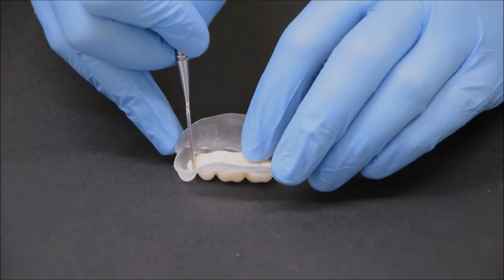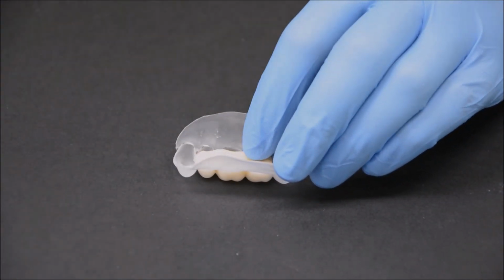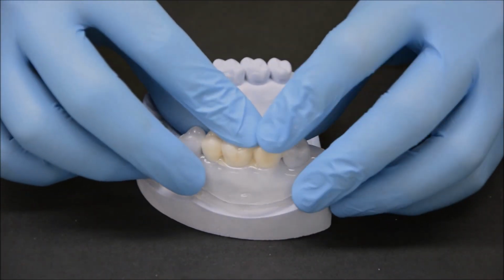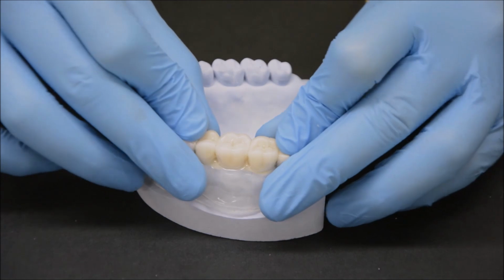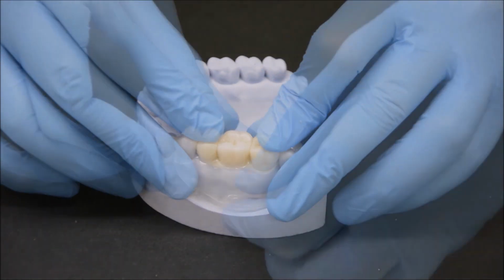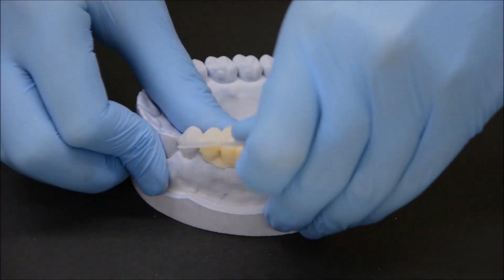Material extending into the adjacent teeth spaces is removed. The thermoplastic mold with PMMA is then inverted onto the prepared cast and adapted firmly to it. This helps to conform the material between the mold and the prepared teeth to form the provisional.